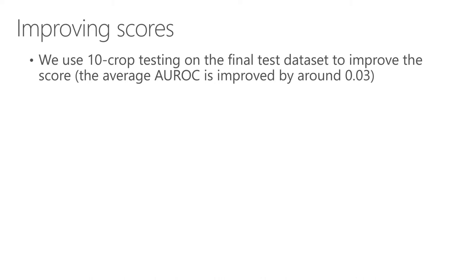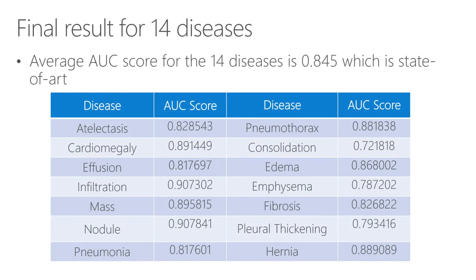Awesome. All right. So you used Keras and TensorFlow. Looks like this is the final result that you got. Yes. So actually we have an AUC score for all the 14 diseases and we sum them together as a single metric for the model. So the 14 diseases are the 14 outputs that you had, right? Yes. Exactly. I see. And so 84, which is very good.